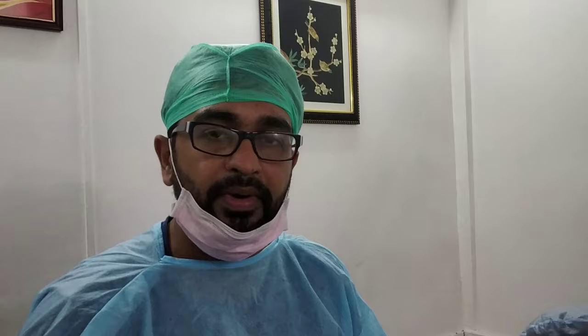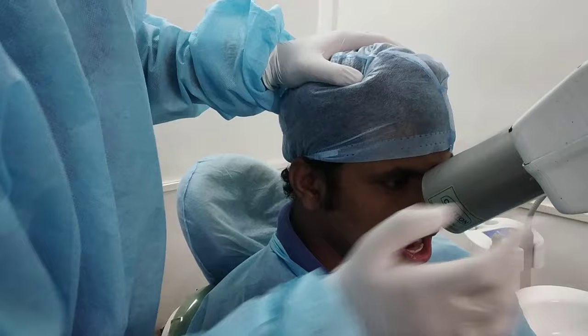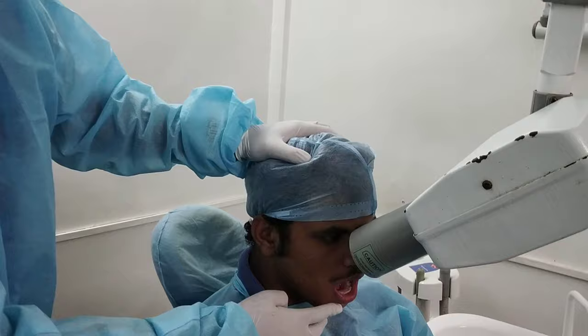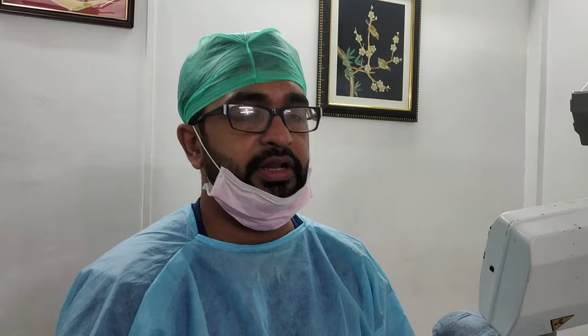While taking the x-ray, we have to keep in mind whatever film you are using — whether it is an RVG or an IOPA film. While using the IOPA film, you should position it properly. Tell the patient to open the mouth, then place the film so that one third or one fourth of the film is visible outside. This angle is around 45 degrees for the upper anterior tooth. You should not take the x-ray incorrectly — if you do, the x-ray will come out either elongated or foreshortened.